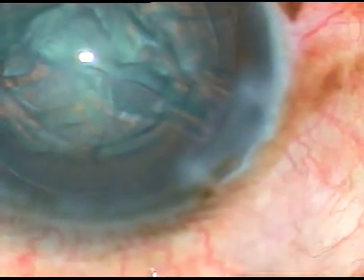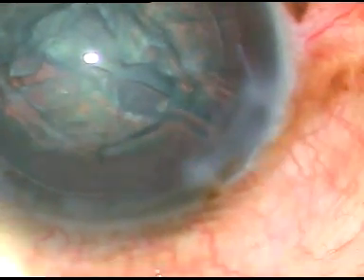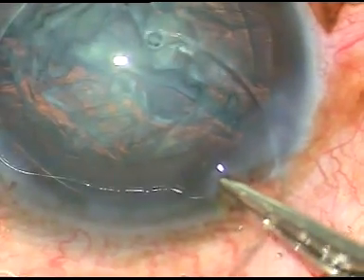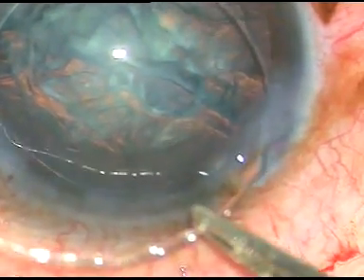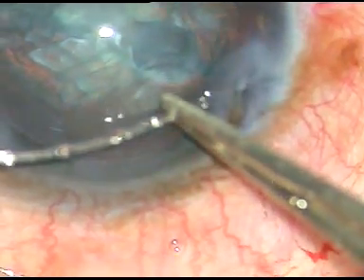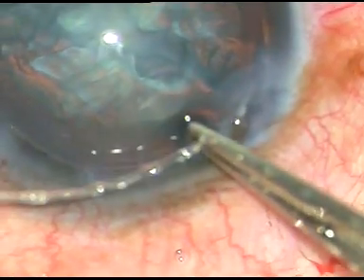I introduce a 23 gauge cannula. I ask my assistant to inject visco, and then I come out. Now I am introducing a CTR, a capsular tension ring.